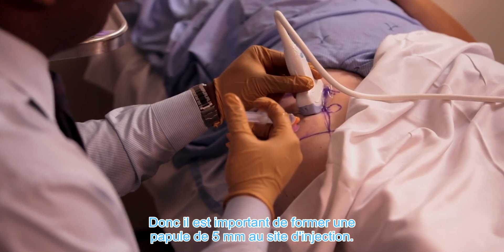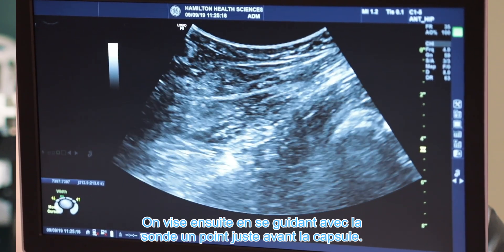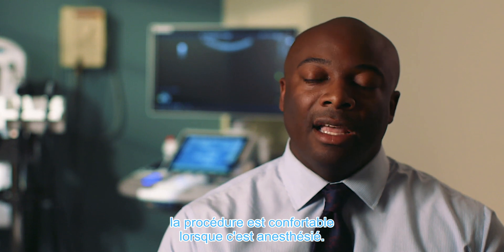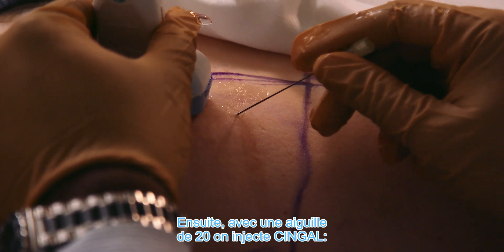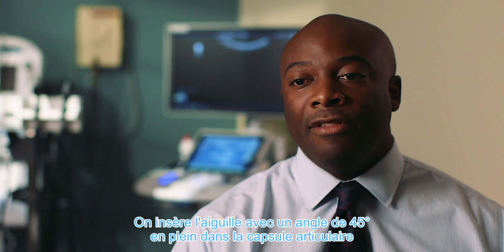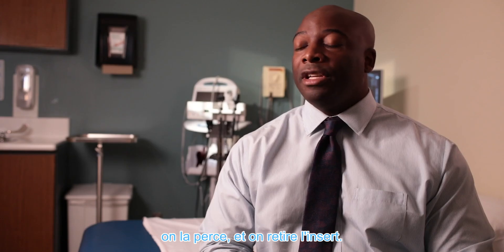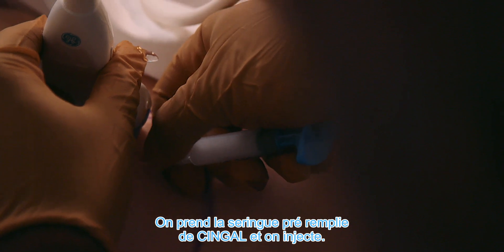Local anesthetic is important to ensure this is a comfortable procedure, because this is a deeper injection. Raising a 5mm skin wheal at your injection site is important, and then aiming using the ultrasound to inject your needle tract just short of the capsule. The spinal needle then follows that same tract down what has been anesthetized, allowing this to be a very comfortable injection. With a 20-gauge spinal needle, you inject CINGAL, delivering your needle under guidance at a 45-degree angle right to the joint capsule, visualizing it on the probe. Once the spinal needle is down to the capsule and you pierce it, you withdraw the insert, tighten the syringe of the CINGAL product, and inject it.